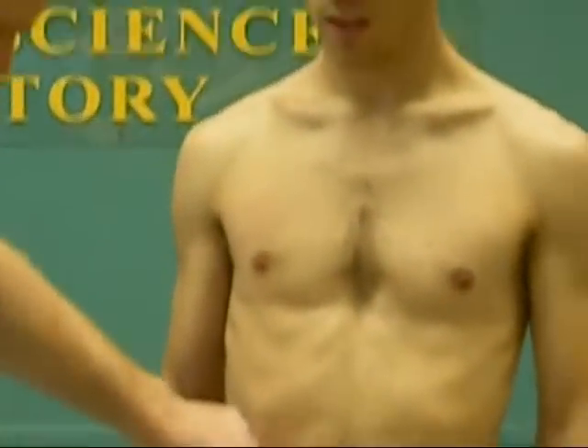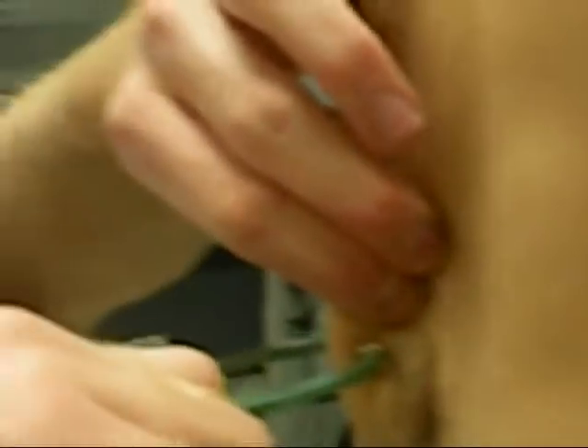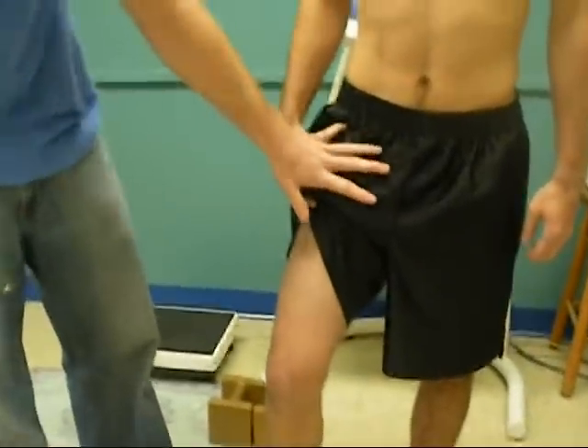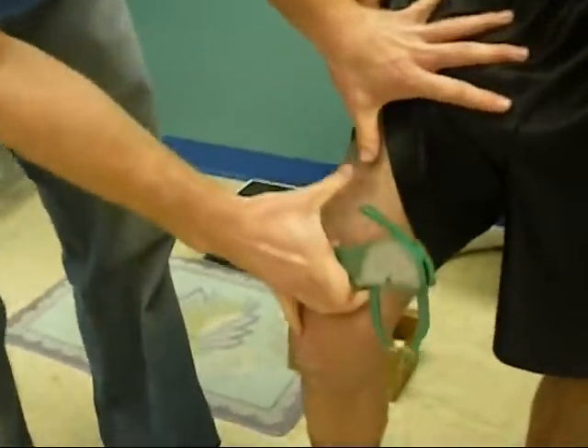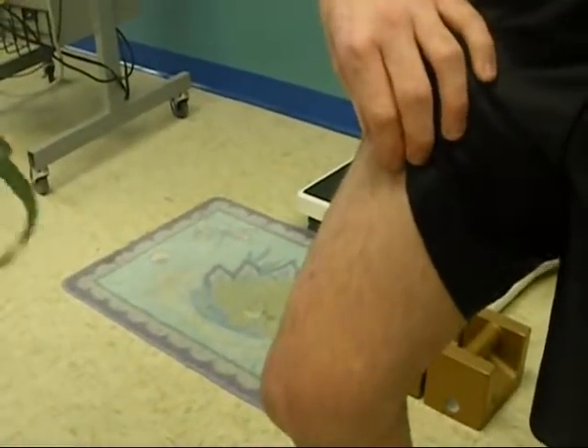For the abdomen, you want to go 2 centimeters to the left of the navel with a vertical fold. Separate the fat from the muscle. For the thigh, a good way to measure is from the inguinal crease to the patella, right where your thumbs meet. Take the measurement there — this is also a vertical fold.